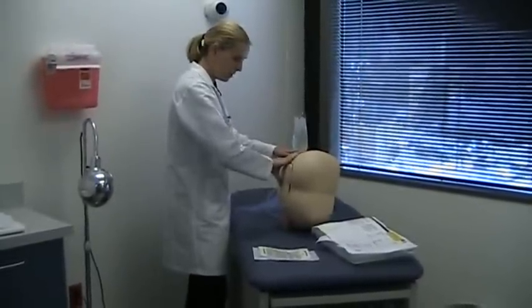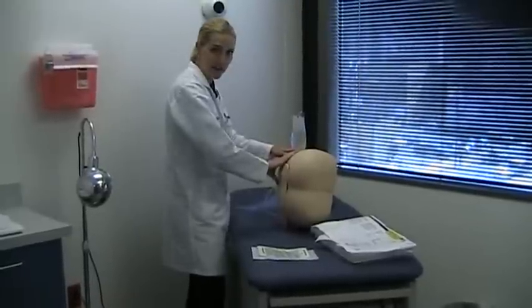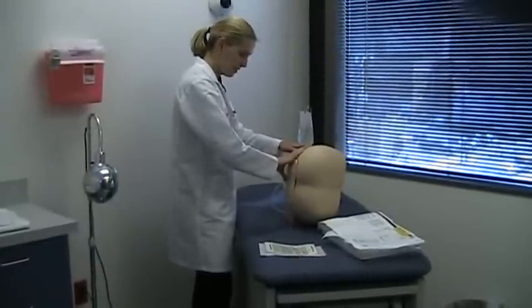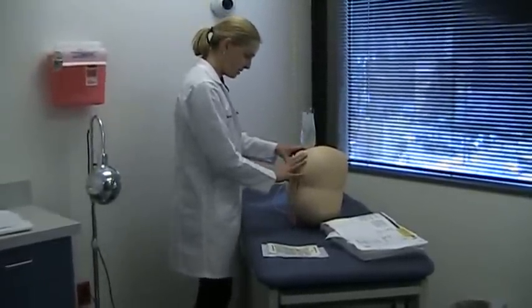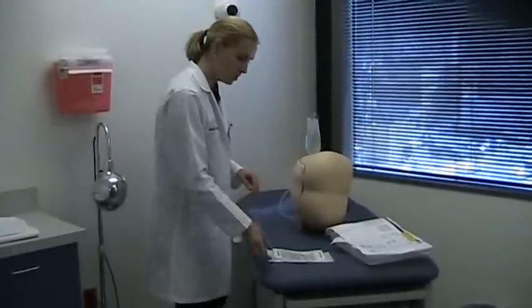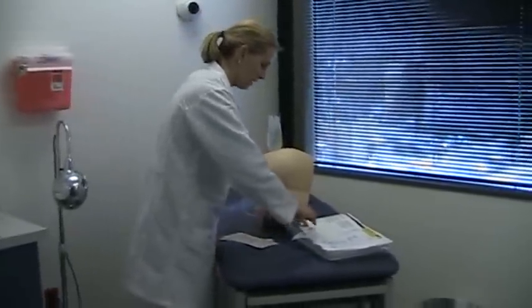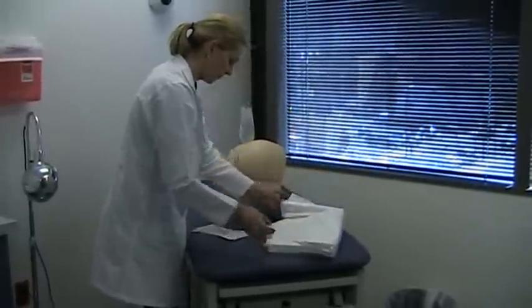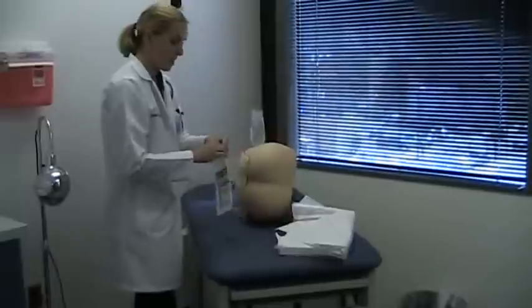The ideal spaces are L3-L4 or L4-L5. I've done the palpation, so I know the position and have an idea where I'm going. I'm ready to start the procedure and set everything up for the LP. I'm going to open the tray, and initially I don't need gloves since I'm just opening the outer pack.